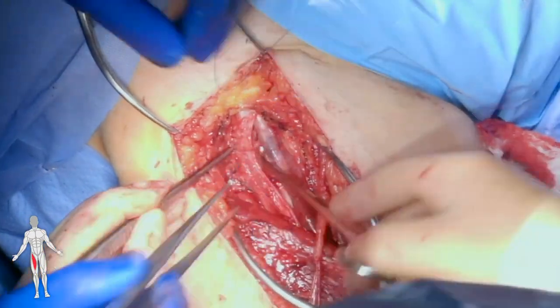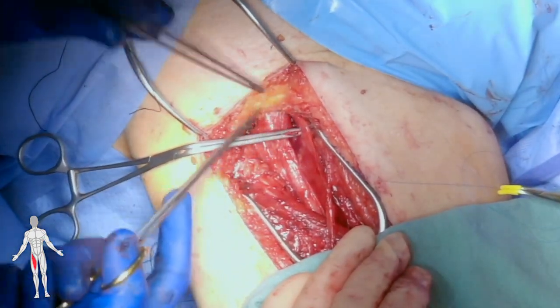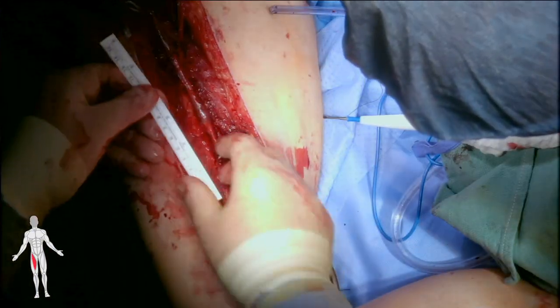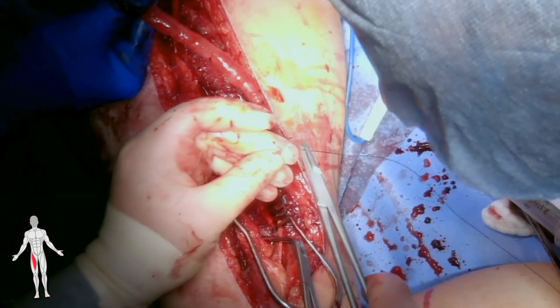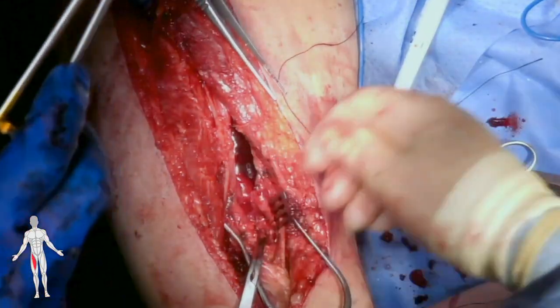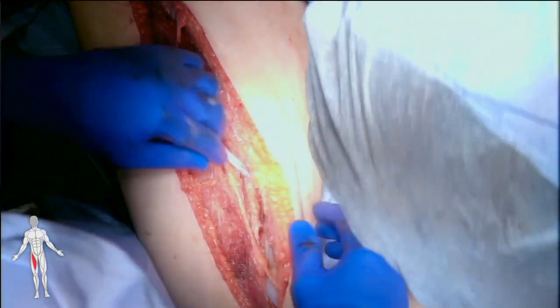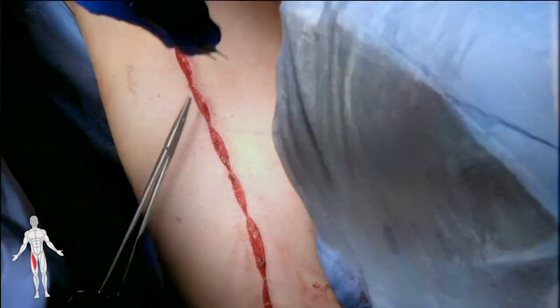To aid in that exposure, the sartorius muscle is reflected laterally. The vein has multiple side branches which must be meticulously — sometimes doubly — ligated to withstand the aortic pressure. The femoral vein is suture ligated flush with its confluence with the profunda vein. With the vein free from its superior attachments, dissection can be continued distally to the level of the knee joint. The vein is measured to ensure adequate length for the planned operation and the distal end marked with suture. The distal stump is then suture ligated. The conduit is then submitted to the blood bank to be preserved overnight for the second stage in Wisconsin solution. We elect to place drains in the harvest bed in order to control for seromas and limb edema. The incision is then closed in a layered fashion using 3-0 PDS and 4-0 Monocryl.